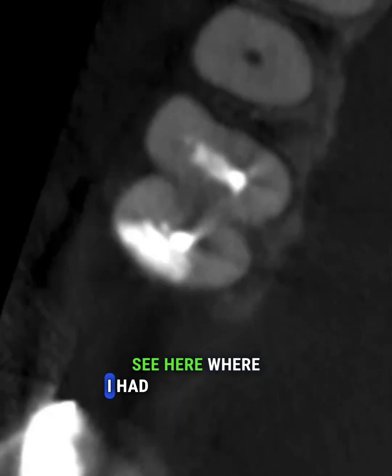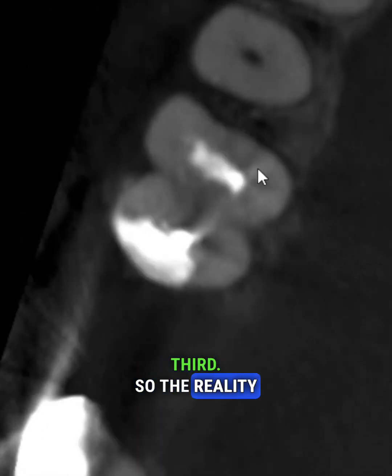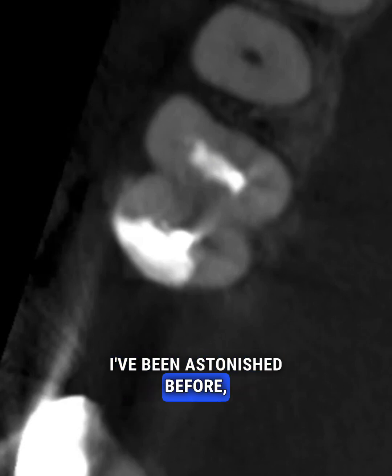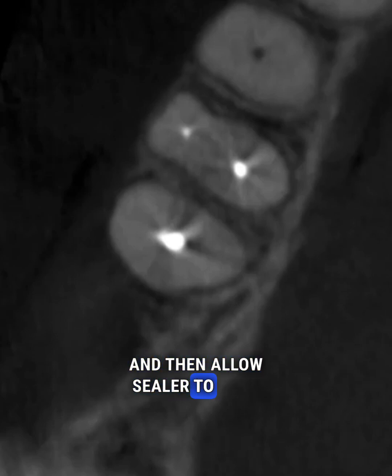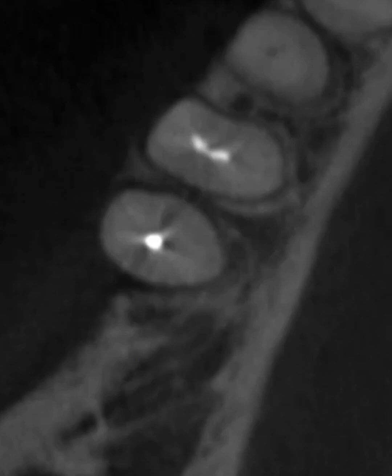And you can see here where I had been searching and probably needed to go a bit more mesiobuccal to find that mesiobuccal canal, but you'll see sealer in it right away up in the coronal third. So the reality is I'm humbled because I couldn't find the mesiobuccal even though I looked so hard. But because I've been astonished before, I recognize based on the anatomy the potential that the laser would actually retro clean and then allow sealer to flow up in that direction. And then I appreciate the grace. The technology allowed me to complete this case without blowing out the coronal third to try to find that mesiobuccal.